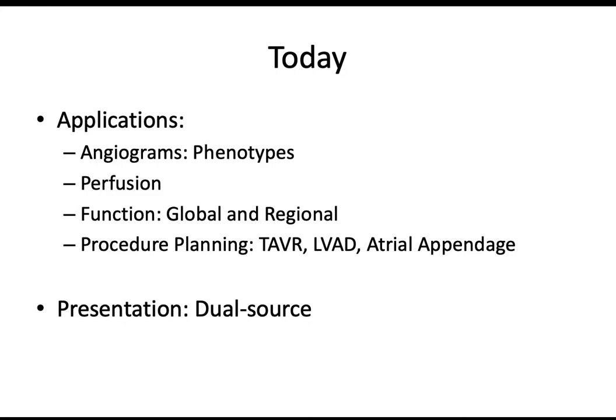And you're going to snake it all the way to the heart, and then you're going to deploy it. But you already have to have measured or guessed what valve you're going to put in. So that has increased the burden on diagnostic measurements that you would want to make and say, is this valve area smaller or bigger, or which of my 3 sizes should I put on the catheter? And then I think we have the presentation at the end. So this is our current overview for today.